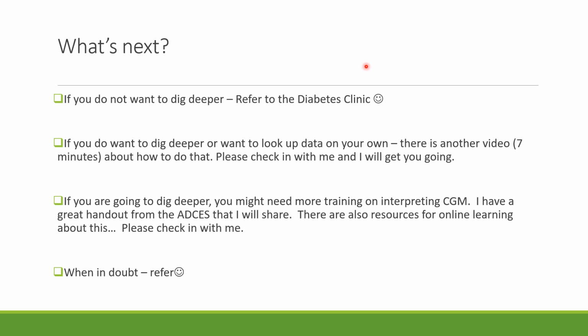If you do want to dig deeper, then you're going to need to get a little more information on how to do that. There's a video on how to access the data, and I can share that with you. And then you might want to get more training on how to interpret CGMs. I have a good handout on that from the ADCES, and there's also really good resources online about interpreting CGM. But when in doubt, please refer to us. If you really feel that the AGP report is not enough information, then refer to us and I will review that with patients.